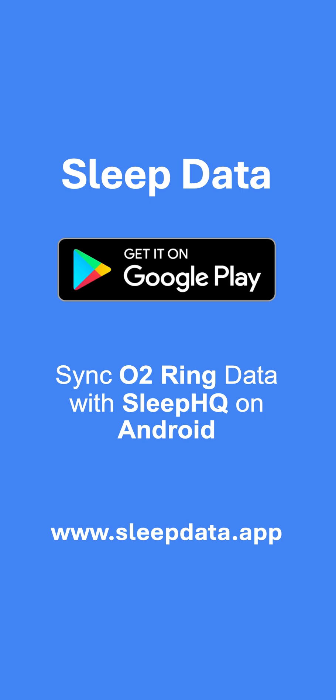Hi, everyone. In this video, I'm going to walk you through how to use the Sleep Data app, which can now transfer O2 data from an O2 ring to Sleep HQ on Android devices. This feature has been available for Apple devices, but now Android users can enjoy it too. Let's get started.